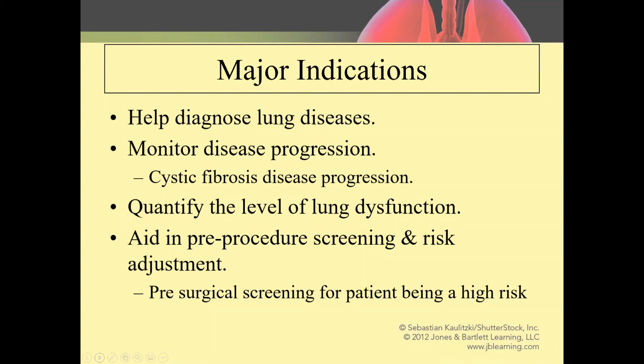To quantify the level of lung dysfunction. So now that you maybe have more specificity on what's wrong with the patient, you can determine the degree of actual dysfunction. And to aid in pre-procedure screening and risk adjustment.